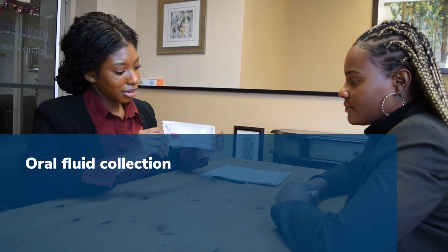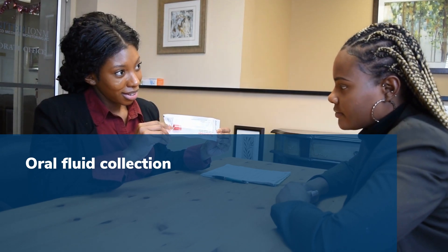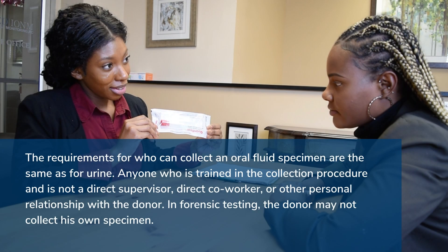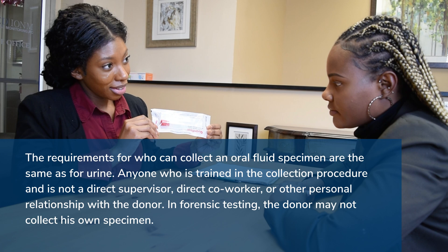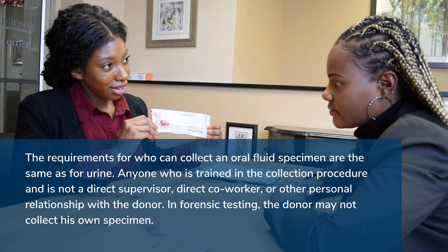Oral Fluid Collection. The requirements for who can collect an oral fluid specimen are the same as for urine. Anyone who is trained in the collection procedure and is not a direct supervisor, co-worker, or any other personal relationship with the donor may collect an oral fluid sample. In forensic testing, the donor may not collect his own specimen.